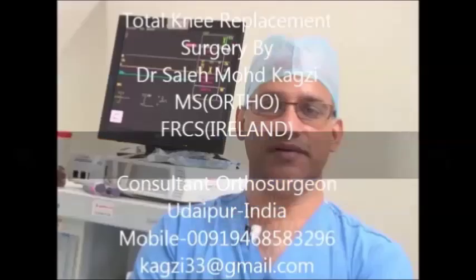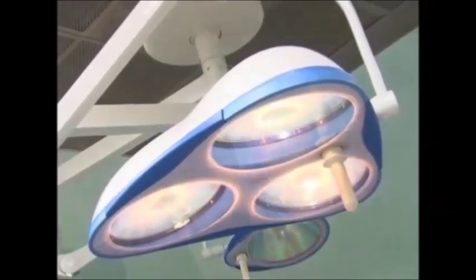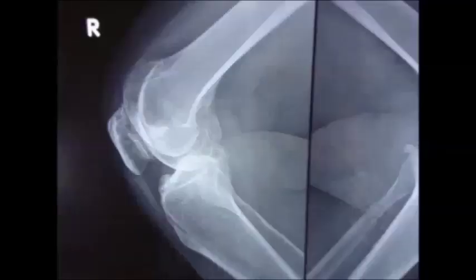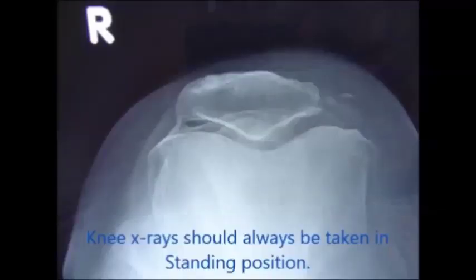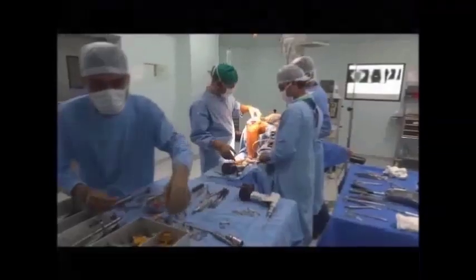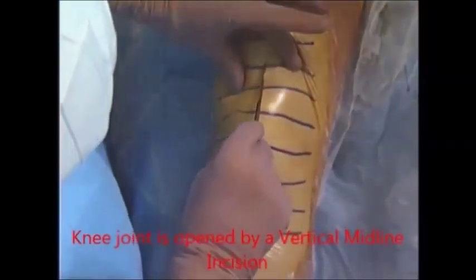In this live video, we will show you what the total knee replacement surgery exactly is. This patient whom we are going to operate is a 78-year-old lady who has been suffering from severe pain in both legs, both knees, for a long time, more than 5 years, and now she has suddenly stopped walking due to severe painful osteoarthritis in both knees. Today we are going to operate on her right knee.